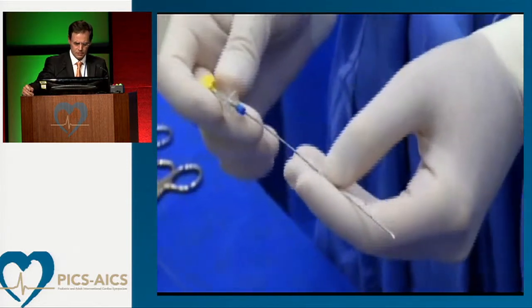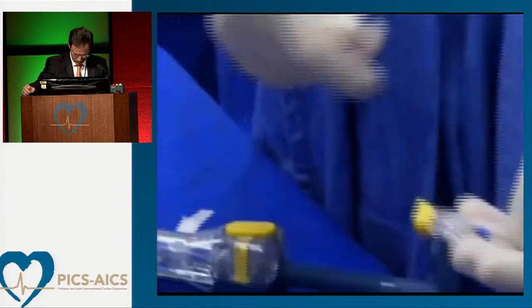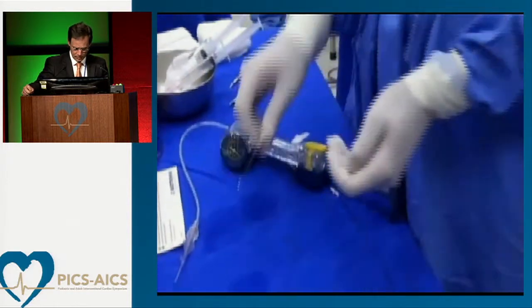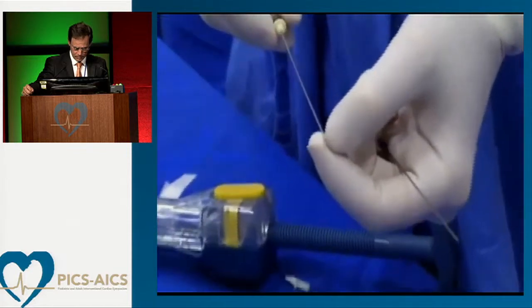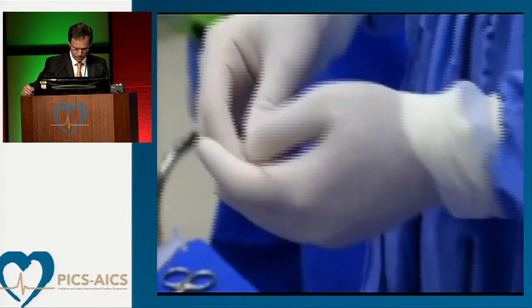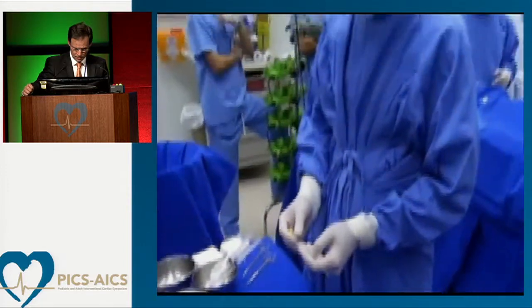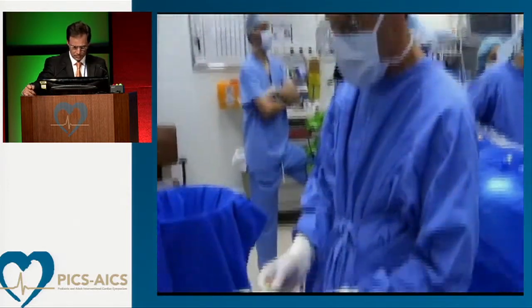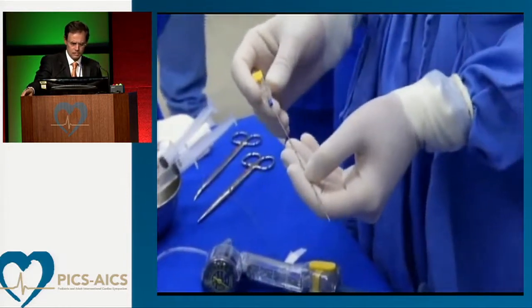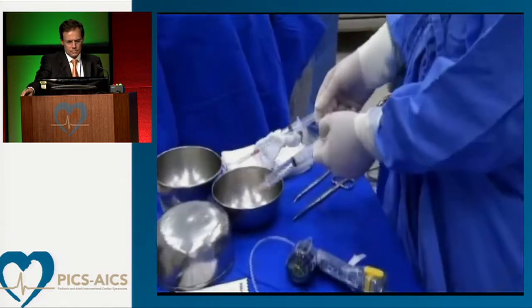needle. Sometimes we get some effusion after the procedure, especially because we have to take everything out at the end of the procedure. Otherwise, the balloon is sheared off by the tip of the needle. So we take everything out, and hopefully in this case we're not going to have any effusion. But if we do have, we can drain by sucking 1 to 2 milliliters of blood using this needle here. Right? We have here everything prepared.